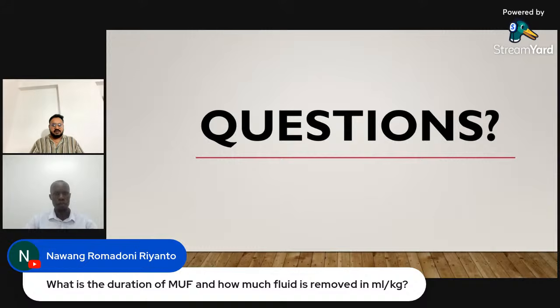The next question is, what is the duration of MUF, and how much fluid is removed in ml per kg? The duration of MUF, we do it for 10 minutes after the case. For us, we do MUF on every patient.